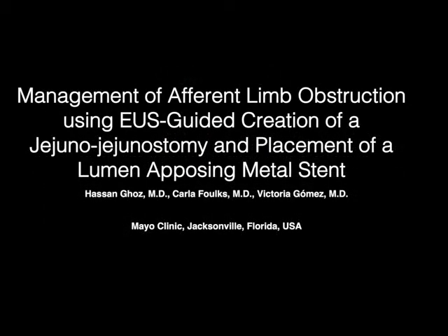Management of afferent limb obstruction using EUS guided creation of a jejunojejunostomy and placement of a lumen apposing metal stent.